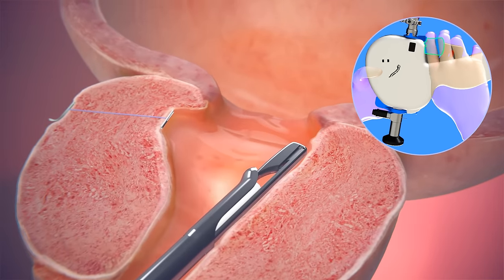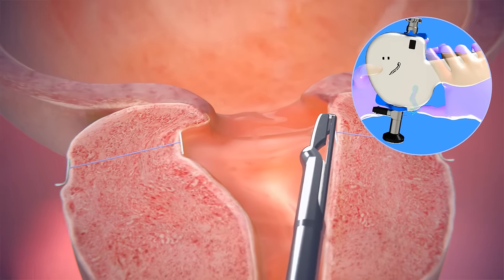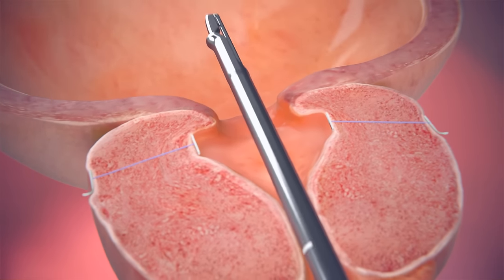Depending on the prostate size and blockage severity, the doctor inserts several more implants the same way. Typically, four to six implants are placed into the prostate.